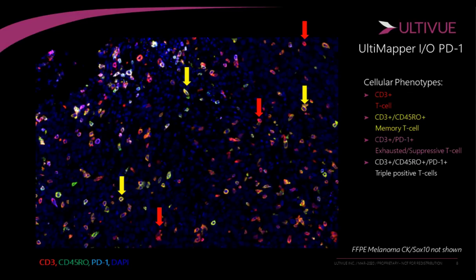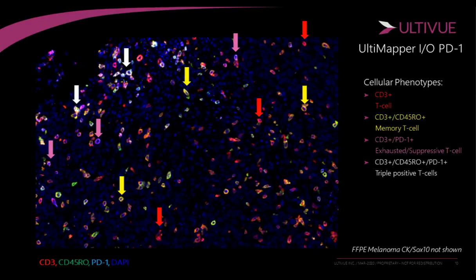Here we're seeing some dual positive CD3 and CD45 RO memory T cells. When you stack two colors on top of each other, you can get new colors — for example, red and green yields yellow, presenting a co-localization of two markers. We're also seeing exhausted suppressor T cells that are CD3 and PD-1 positive in a pink to purple color, and triple positive cells shown in white. You'll also see cells of different color variations showing qualitative dynamic range — low, medium, and high expressors — which you can further threshold in analysis tools.